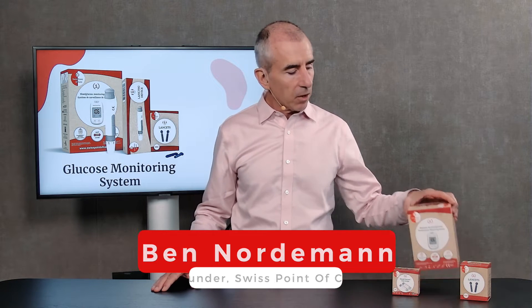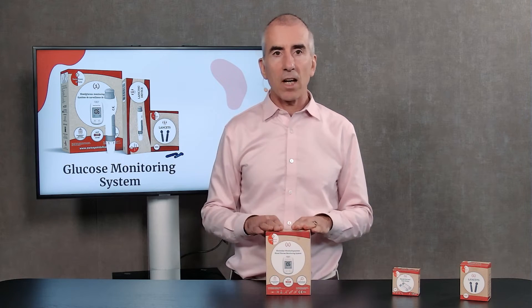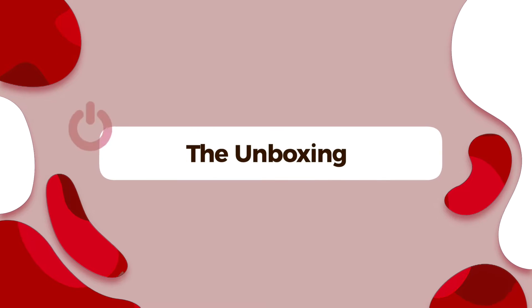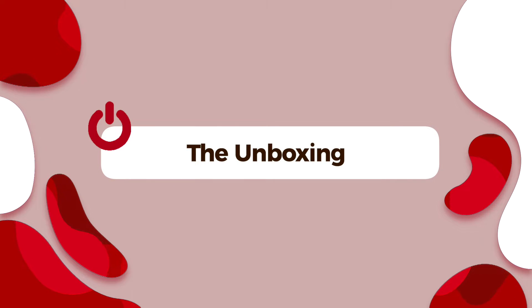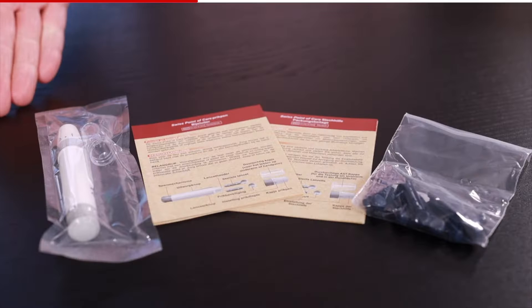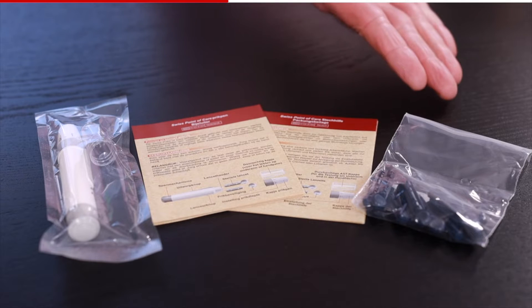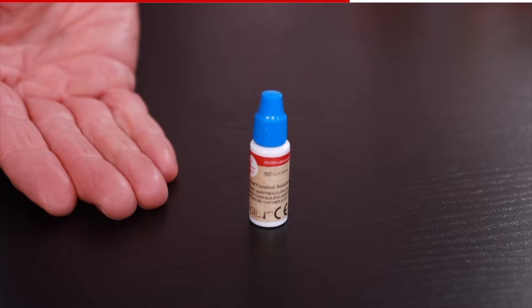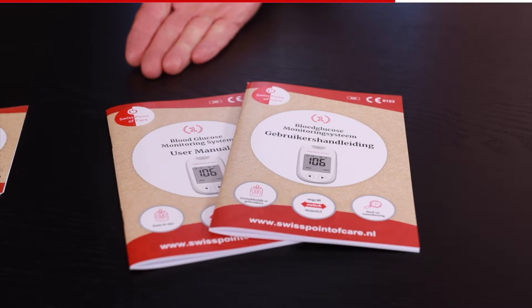Let's start by taking a look at the box — we'll be unboxing it. Inside the box there is everything you need for your first 10 glucose tests. So I've put everything in front of me: there's the meter, the two little batteries that go inside, the lancing device and the lancets which are the little needles, including an explanation of how that works. There are the test strips and the control solution, and a quick start guide and manuals in different languages.